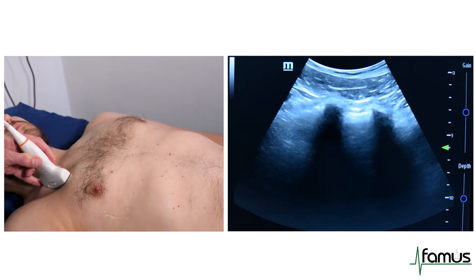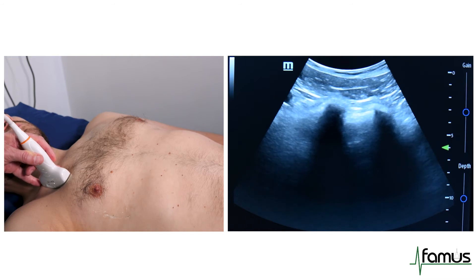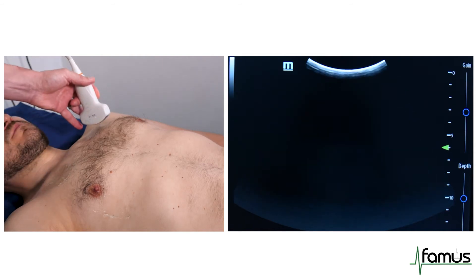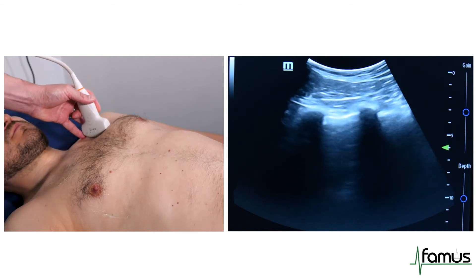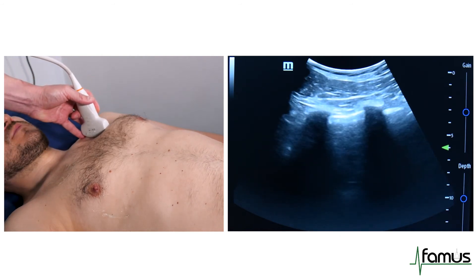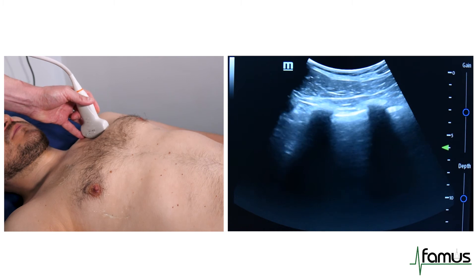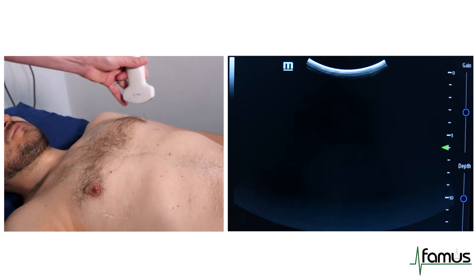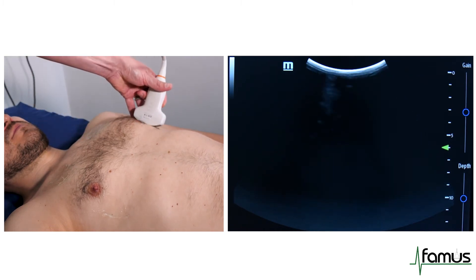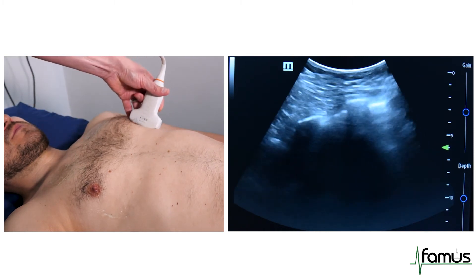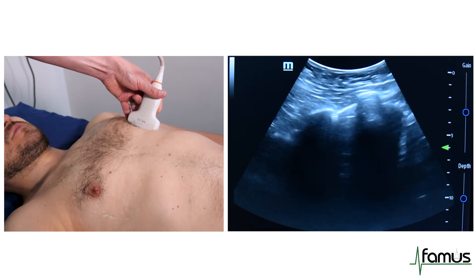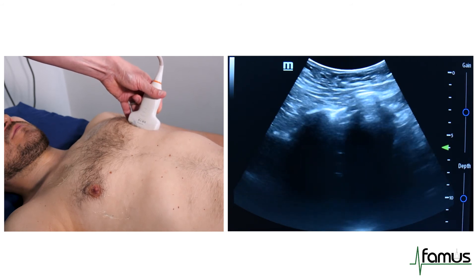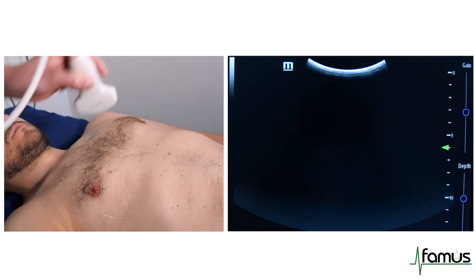We then move to the other three anterior lung zones on the opposite side of the chest, and you'll notice the picture generated is almost identical, and then the lower anterior lung zones — again, very similar images generated.